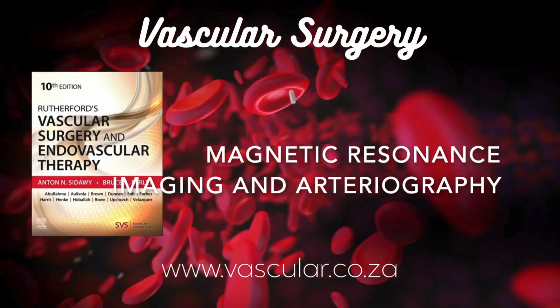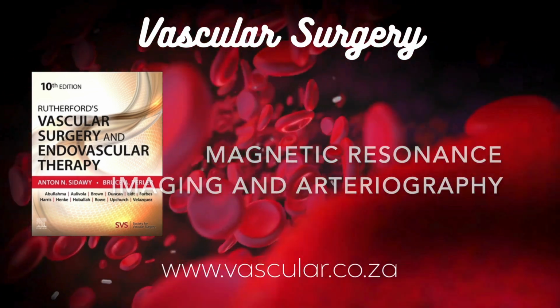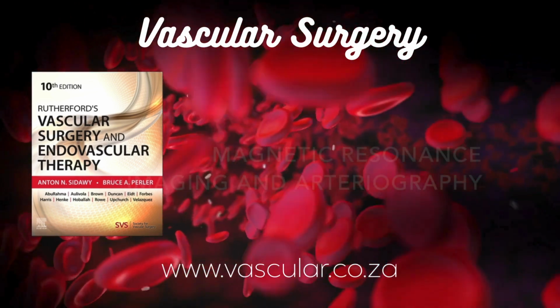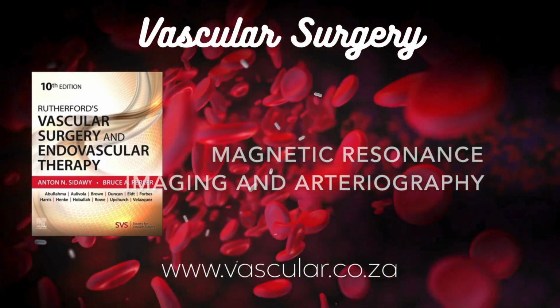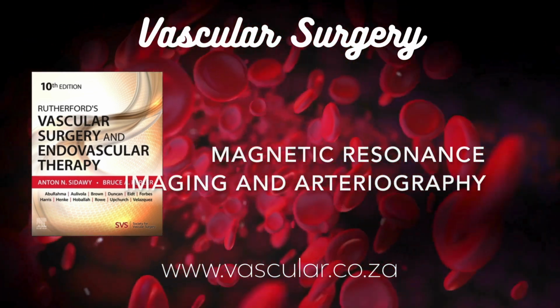That's exactly what it is. You try to synchronize the speed of the table movement with the speed that the contrast agent is traveling down the arteries. So you're always imaging where the contrast is brightest in the arteries. That's the goal. It helps maintain good arterial enhancement throughout the whole run and can really reduce that venous contamination problem we mentioned. That sounds like a neat way to get long coverage with good arterial signal.